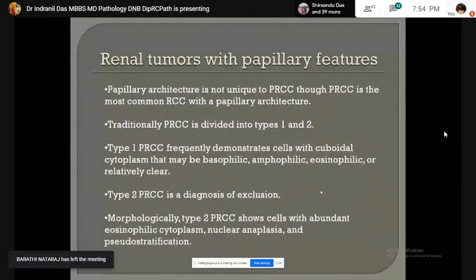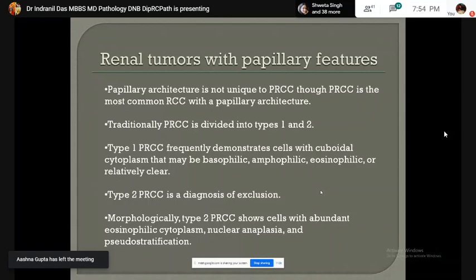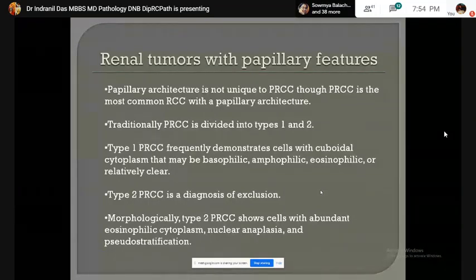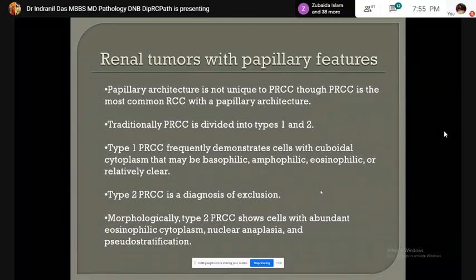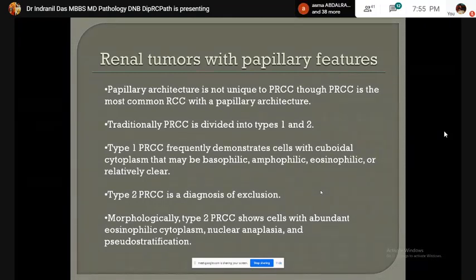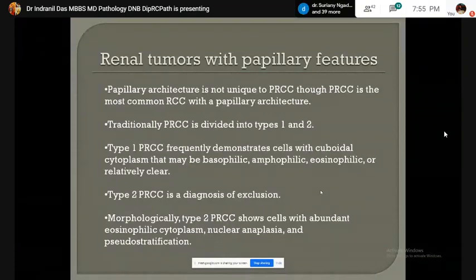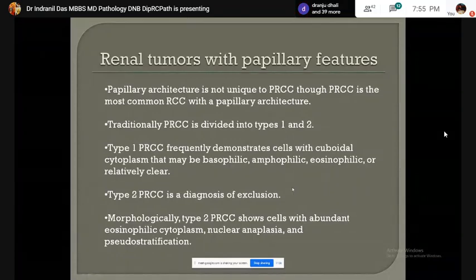Renal cell tumors with papillary features: papillary renal cell carcinoma is the most common tumor with papillary architecture. They are divided into type 1 and type 2. Type 1 papillary RCC shows smaller cells with a moderate amount of amphophilic cytoplasm. Type 2 papillary RCC shows nuclear anaplasia, pseudostratification, and abundant eosinophilic cytoplasm. Foamy macrophages are present within the fibrovascular core and psammoma bodies are also seen.